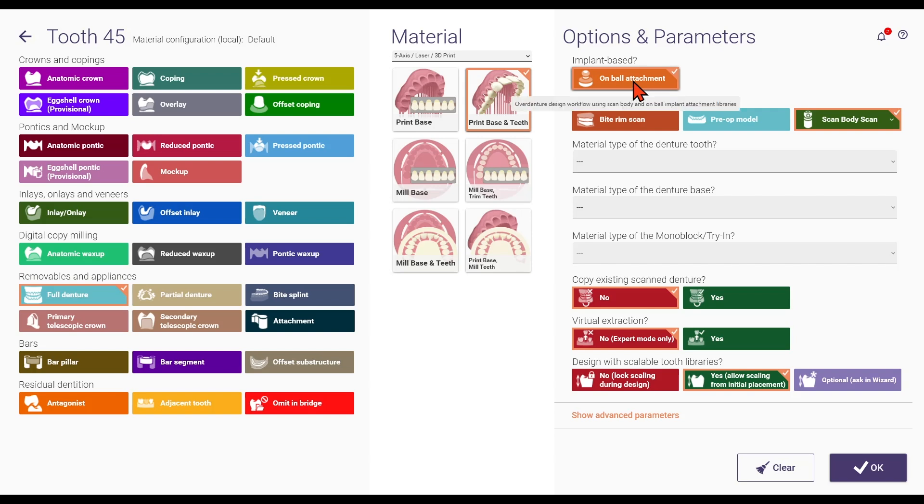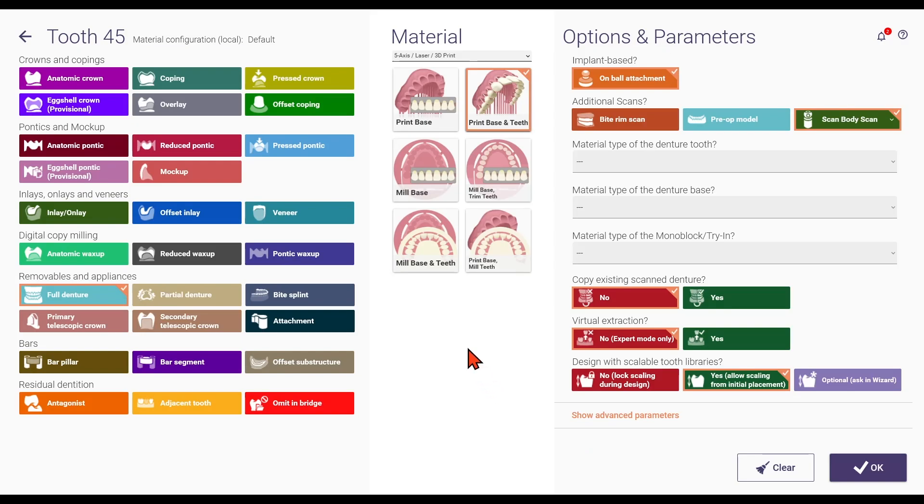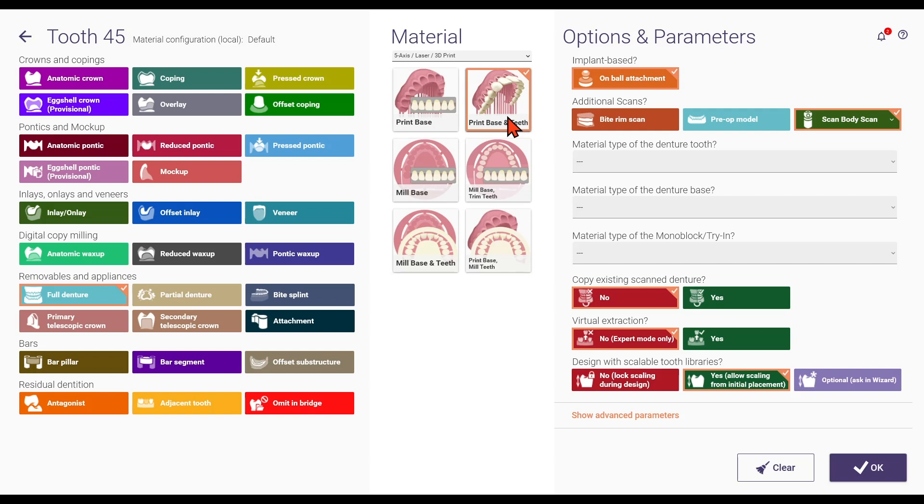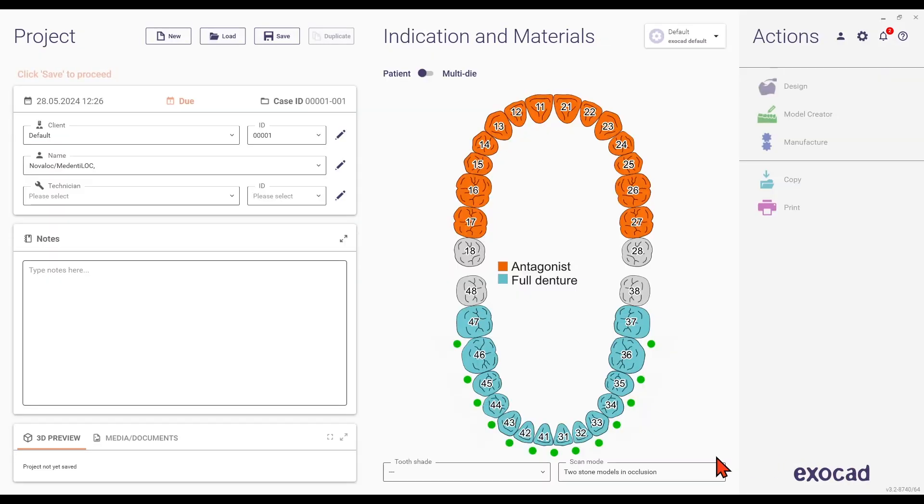In the additional scans section, select the scan body configuration. For tooth position 47, follow the same steps as before, ensuring the full denture configuration is selected. Repeat for any other non-implant-based teeth by holding down the control key and clicking on the individual tooth positions.